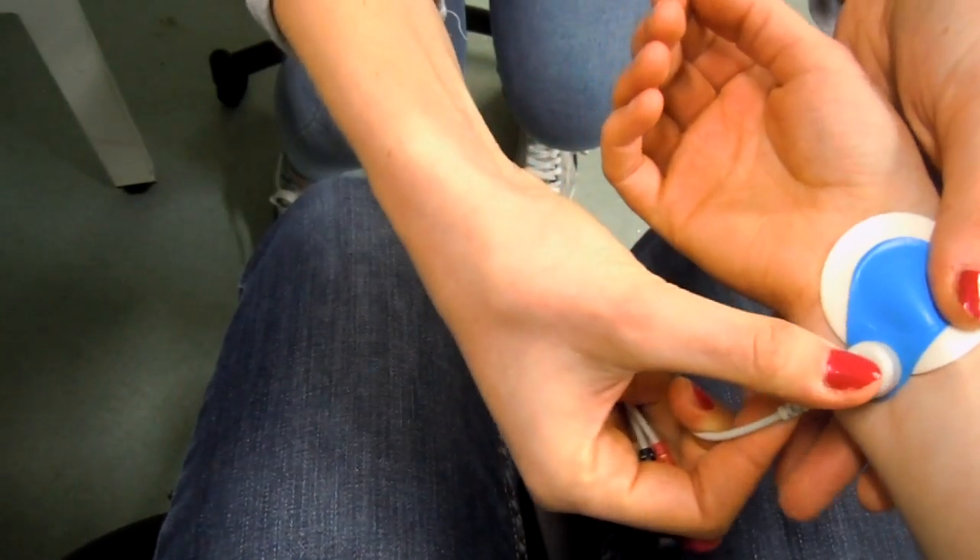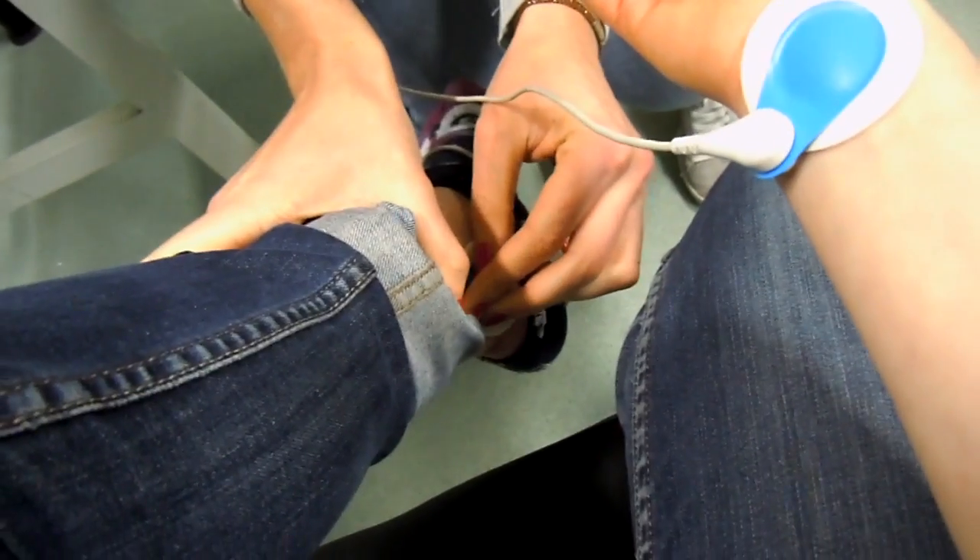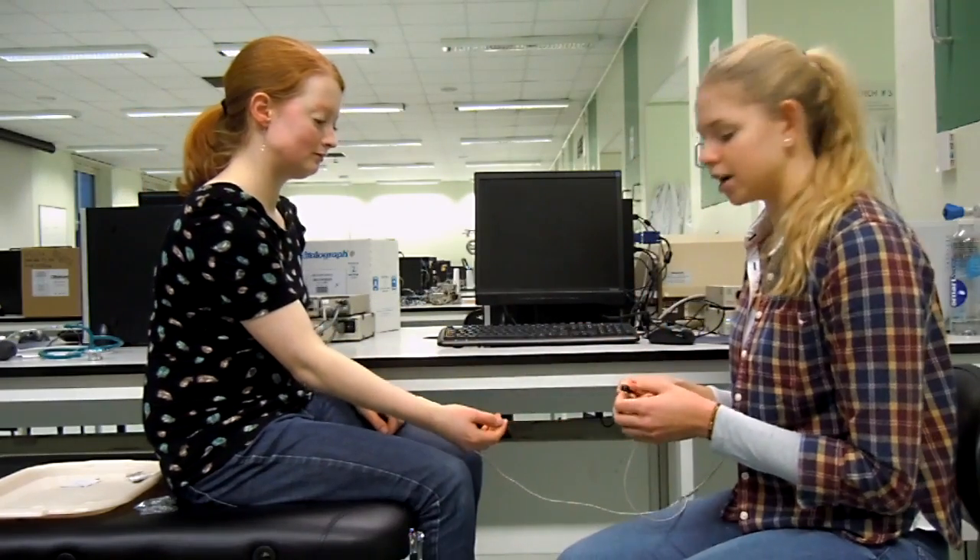I'm going to hook Rachel up to the ECG. We've got a positive, negative, and earth electrode. The positive electrode is going to be going onto the right arm, the negative electrode onto the left leg, and the earth electrode onto the right leg.